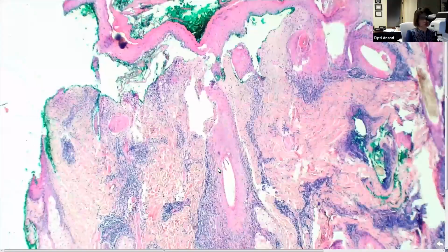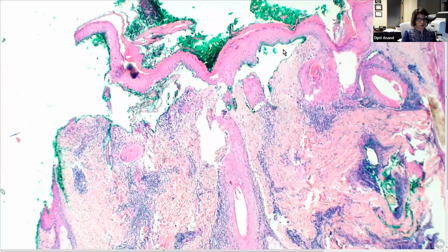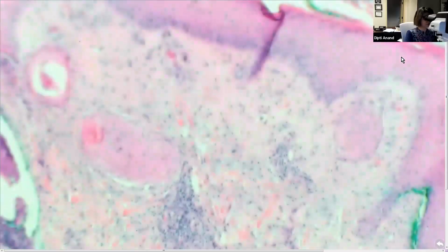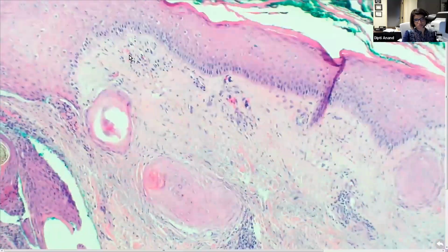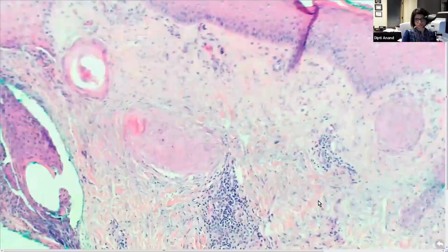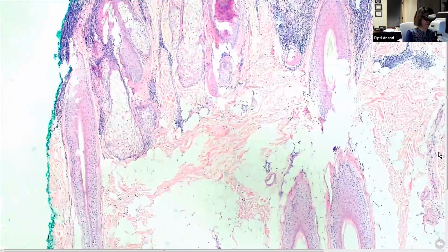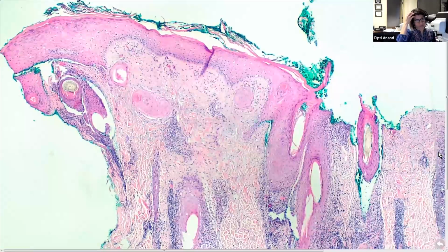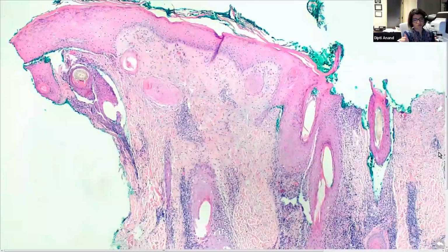And what does the overlying epidermis show? Now here, there is an artifactual blister. That's because of the liquefactive degeneration, because there is massive destruction of the basal layer. And when you look in here, what do you see? You can see the nice interface change. You can see the thickening of the basement membrane. You see the plugged follicles. So this is classic DLE. You can also see some mucin in the slide in here. So that's your classic DLE with secondary mucin and all the chronic interface change. Good? Yep. Okay. The next one is your slide number 6.